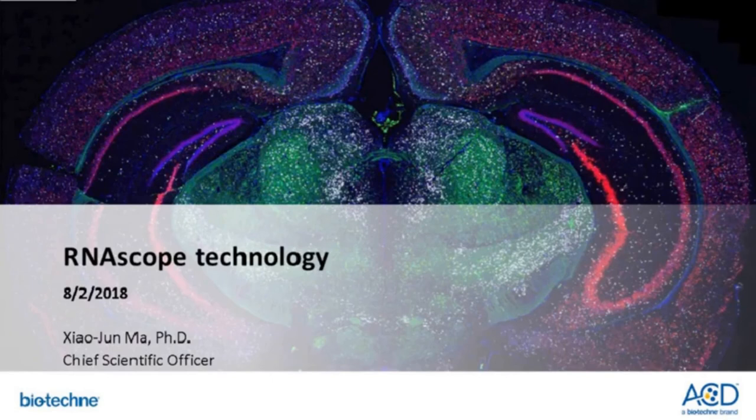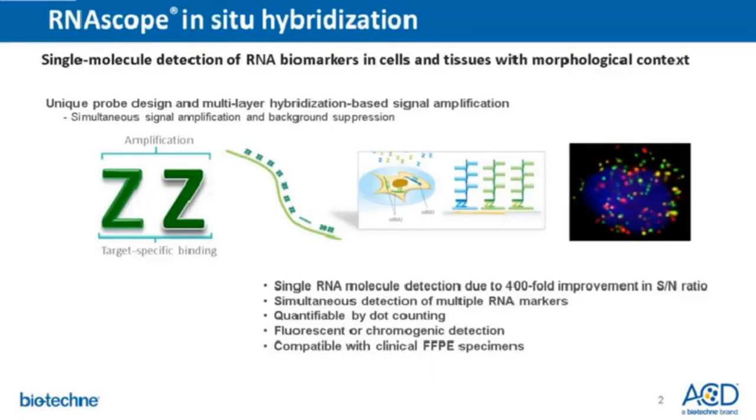Thank you, Xiang, for a great introduction, and also thank Omer for a beautiful example showing how RNAscope can be used for in situ transcriptomics. RNAscope is an in situ hybridization technique. In situ hybridization has been around for more than 40 years. RNAscope is different from other methods in its probe design strategy, as shown here by a pair of Z's. We call these double Z probes.